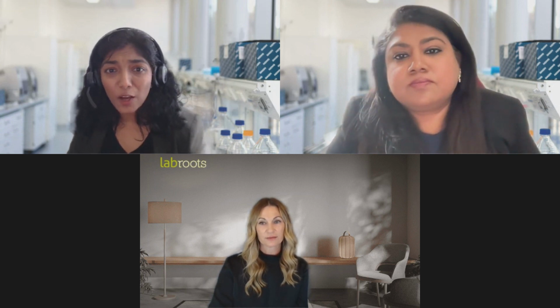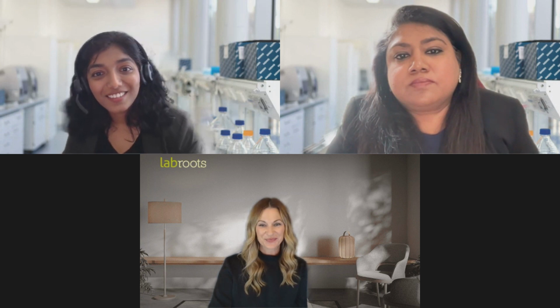Because many times customers will see that they don't need as much as we recommend. But of course, by our recommendations, we'll always want to make sure that you have enough reads to be able to call the variant allele frequencies that you're targeting. I hope that answered that question.